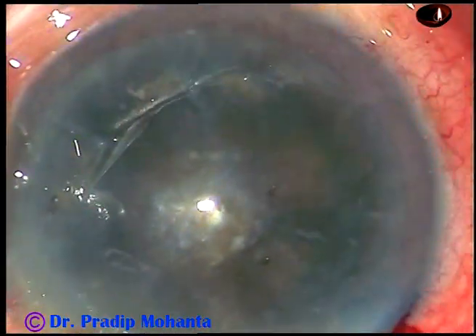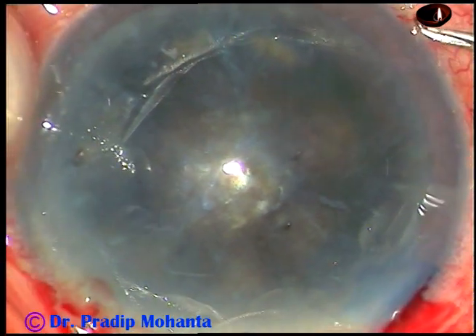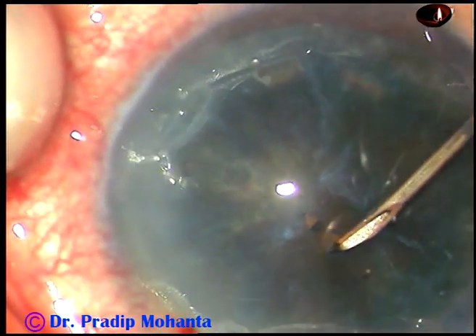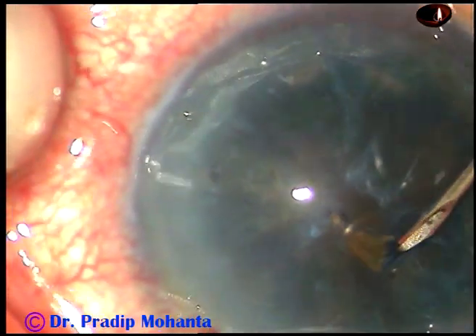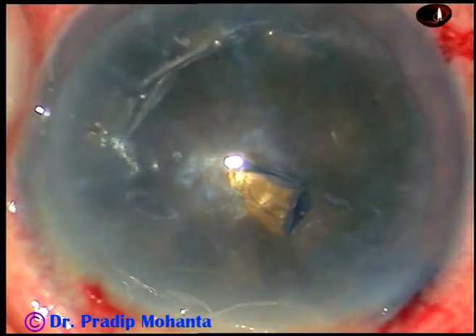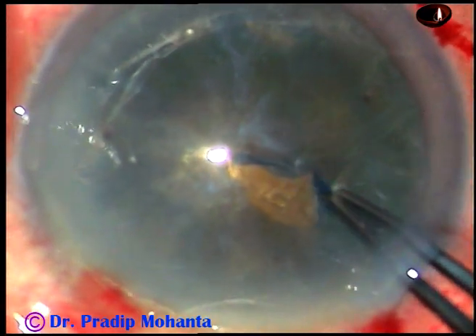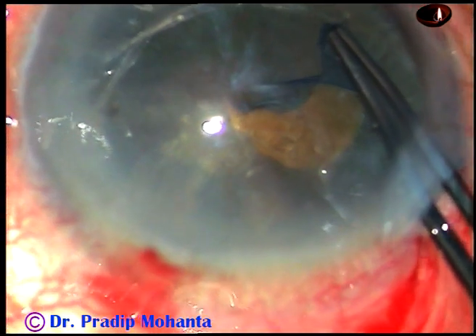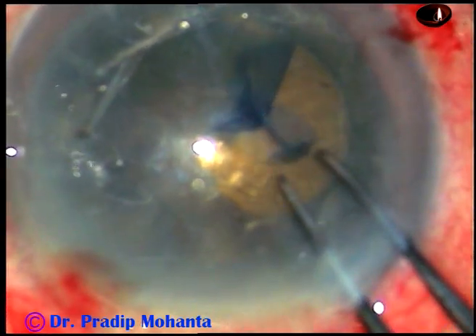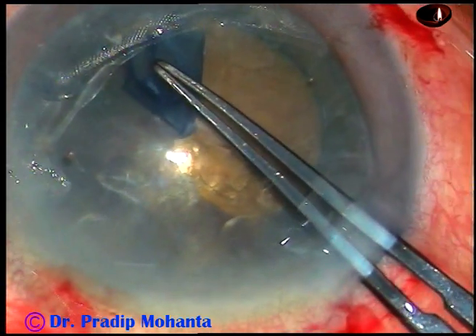Now capsulorhexis is to be done. A 26-gauge bent needle is introduced, the anterior capsule is incised, and a capsular tag is raised. Now I use a utrata forceps to hold this tag and go anti-clockwise, performing a continuous curvilinear capsulorhexis.